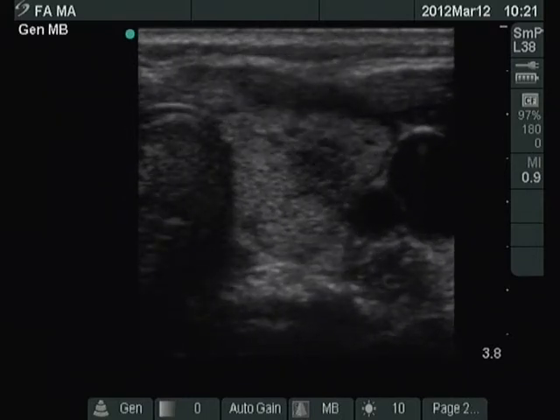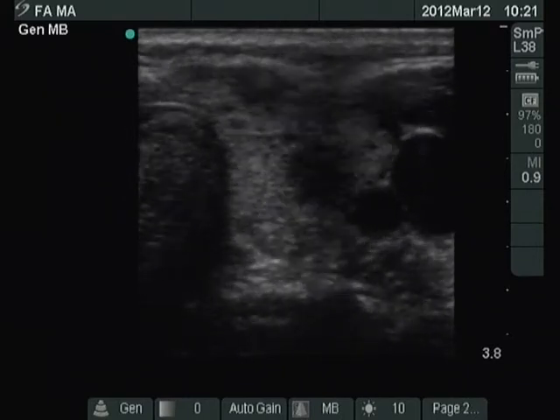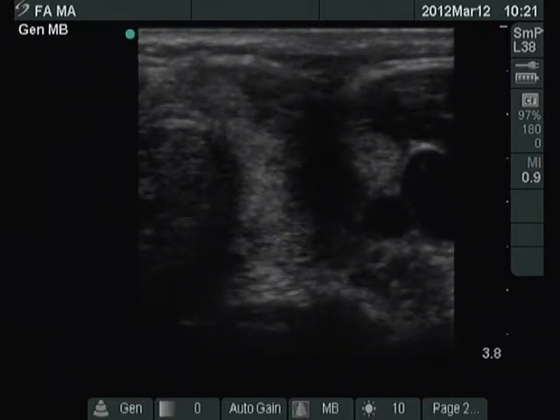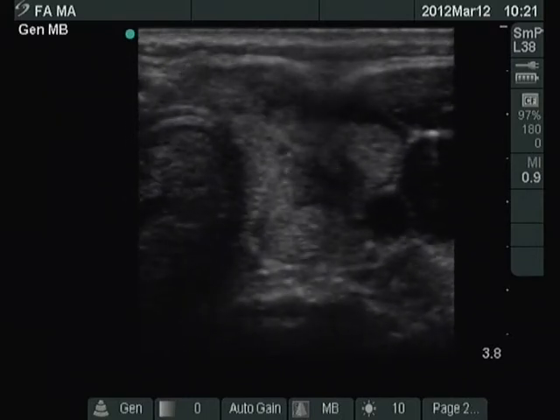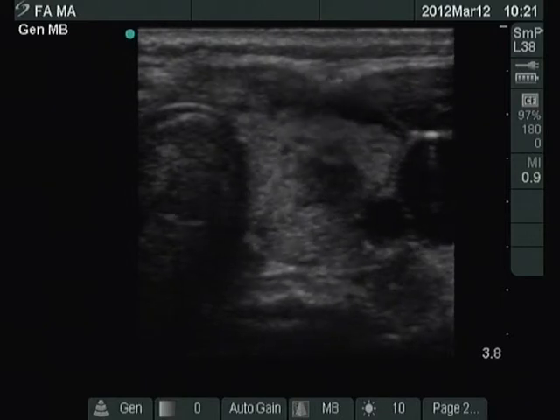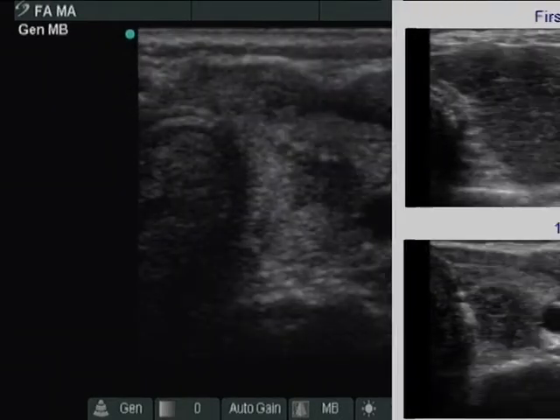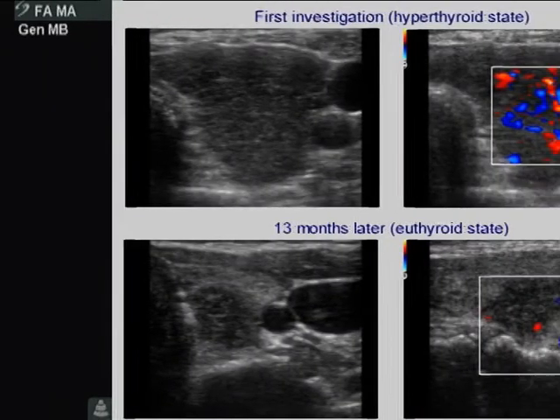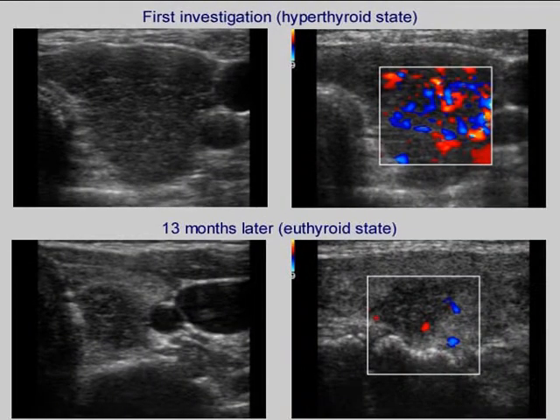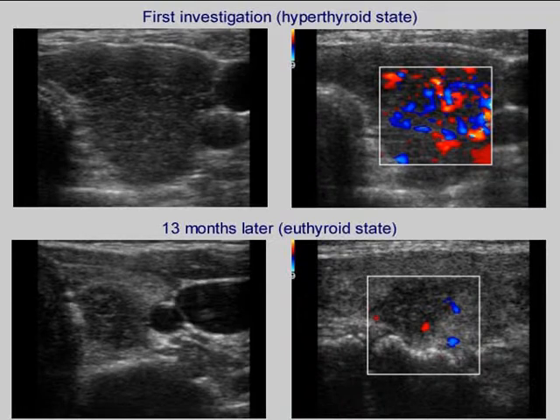An ultrasound-guided aspiration is demonstrated. Compare the ultrasound images of the left lobe at the first and at the follow-up investigations.